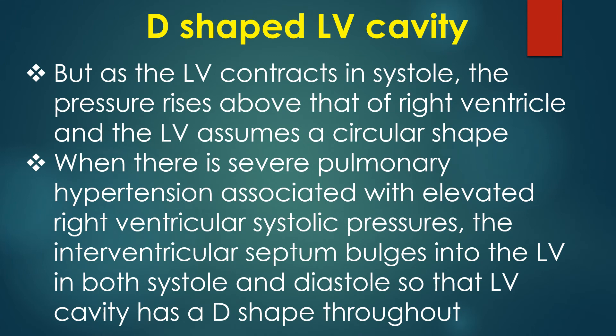But as the left ventricle contracts in systole, the pressure rises above that of the right ventricle and the LV assumes a circular shape.